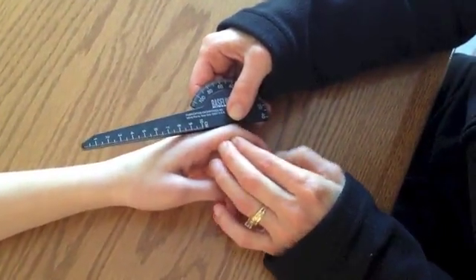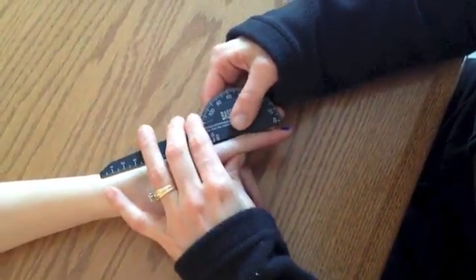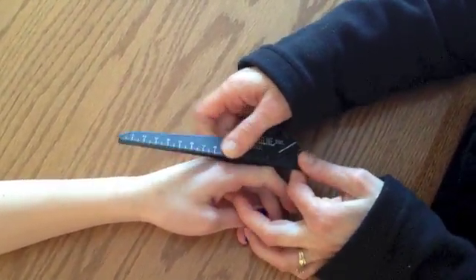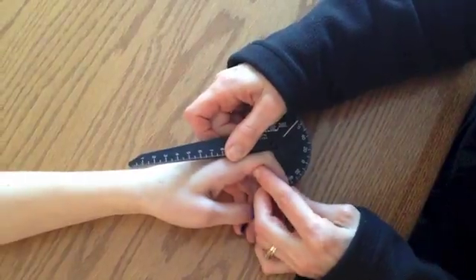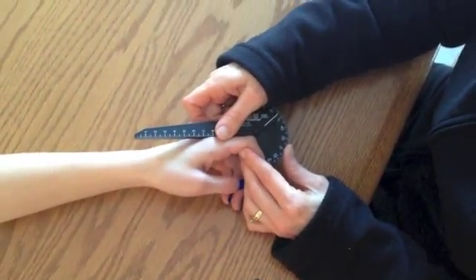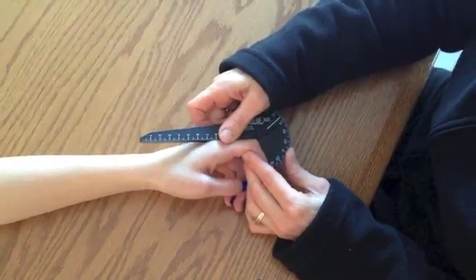Flexion is this. And she is 0 to 68 degrees.